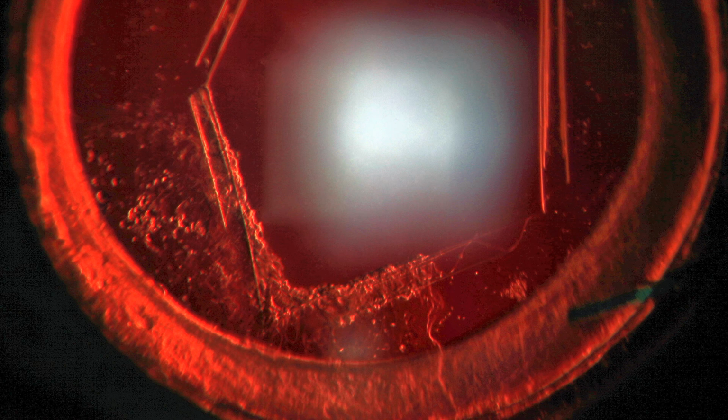Years after performing a YAG laser treatment, you will often see these kind of Soemmering formations at the edges of the capsular opening. You can easily avoid this by investing some extra time. You should carefully clean the surface of the capsule of lens epithelium by applying a number of low-energy laser pulses, as you can see in this animation. This will result in clean and perfectly curled capsule edges.